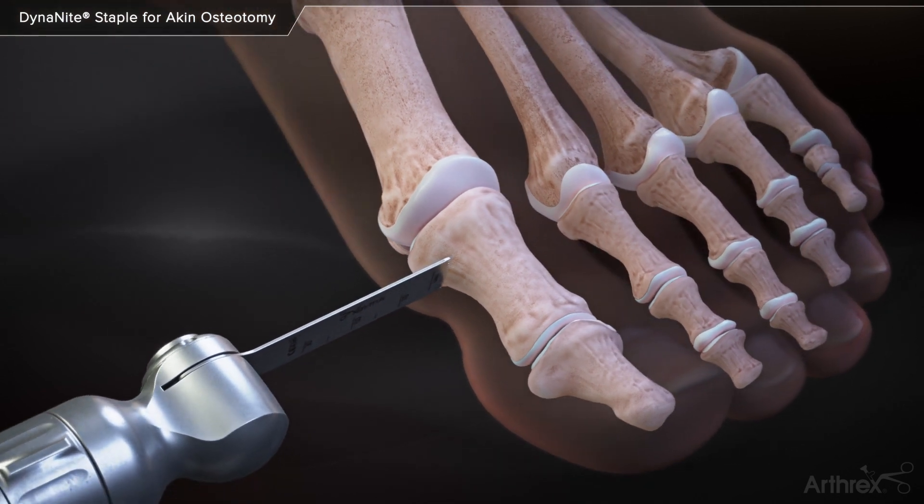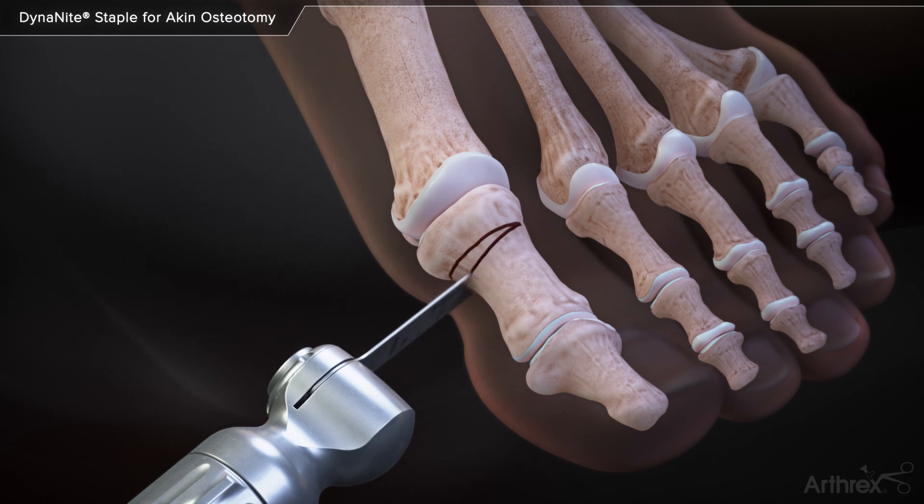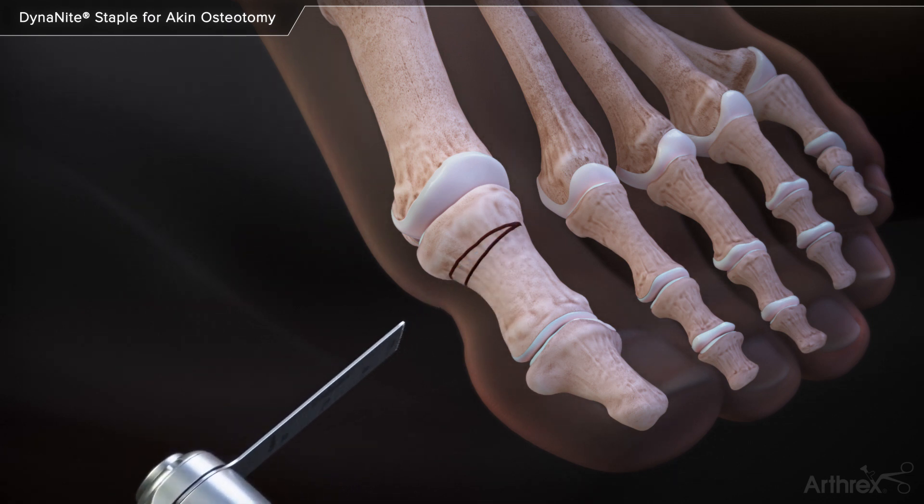A saw is used to create a closing wedge osteotomy. The lateral cortex is preserved to enhance the stability of the osteotomy.